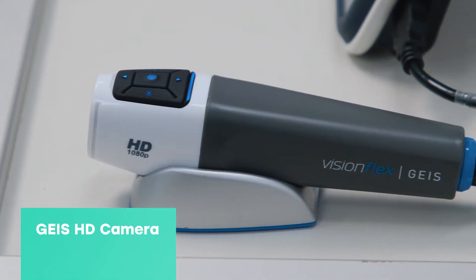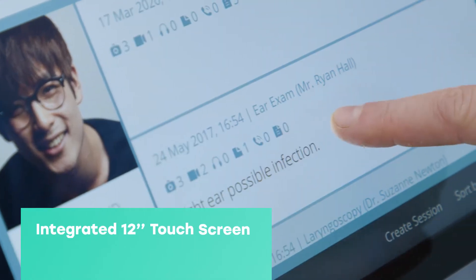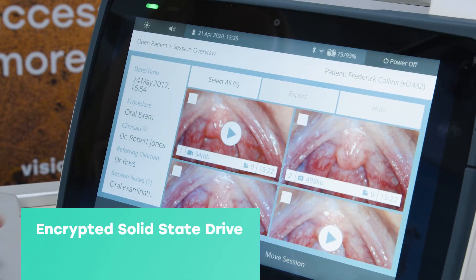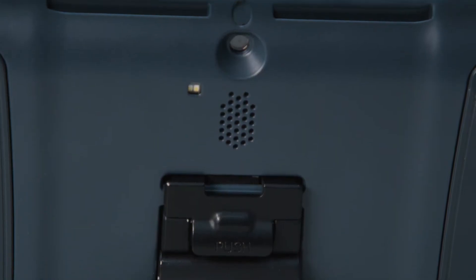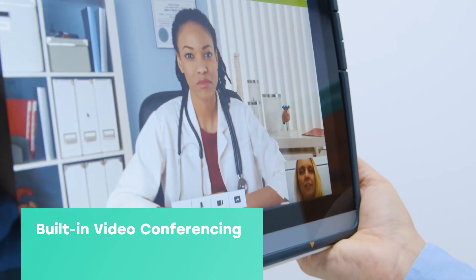Along with the GEIS high-definition exam camera, the Pro EX Mobile includes an integrated touchscreen, a powerful patient data management interface, and robust solid-state encrypted hard drive for storage of video, still images and data, with the ability to connect to remote health services through its built-in video conferencing capabilities.